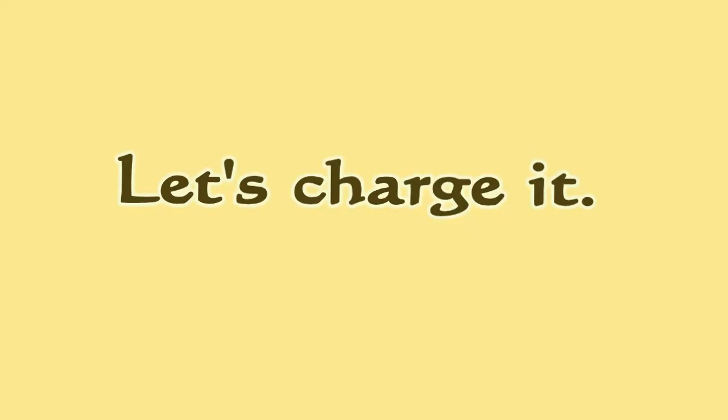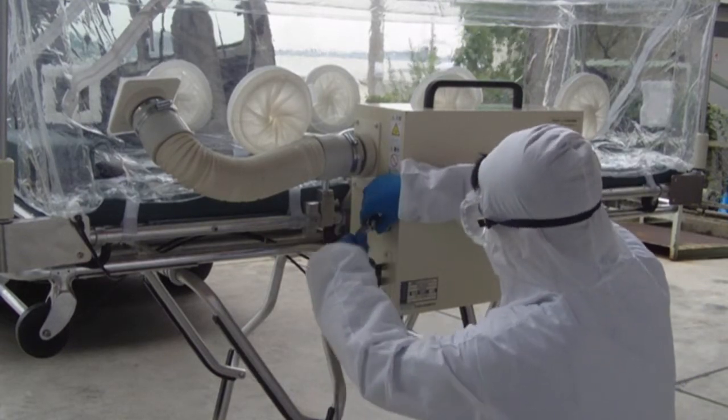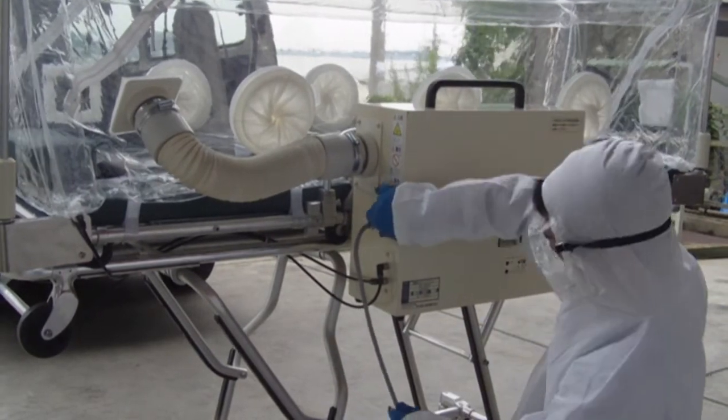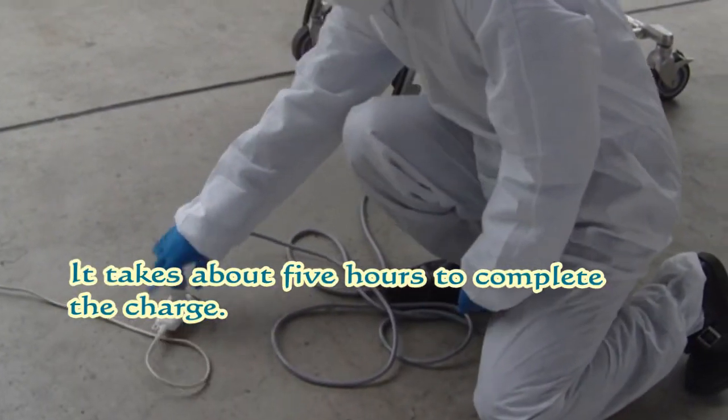Let's charge it. The cable for charging is connected with the electrical fan box. The plug for the charge cable is inserted in the outlet. It takes about 5 hours to complete the charge.